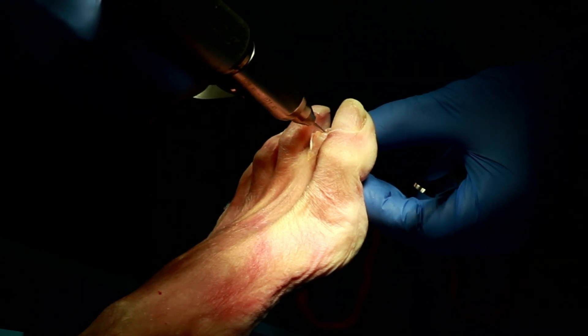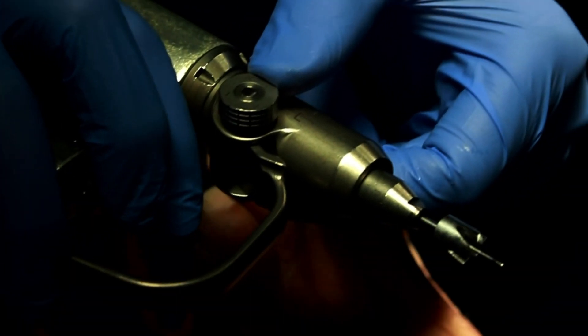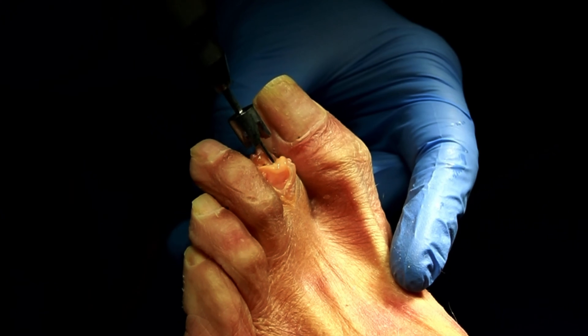You want to create the hole beyond the DIP joint so it comes out the tip a little bit and then back. This is usually done with a battery drill using the larger collet set on small to grab each of the stems, and that holds up really well to spin those.